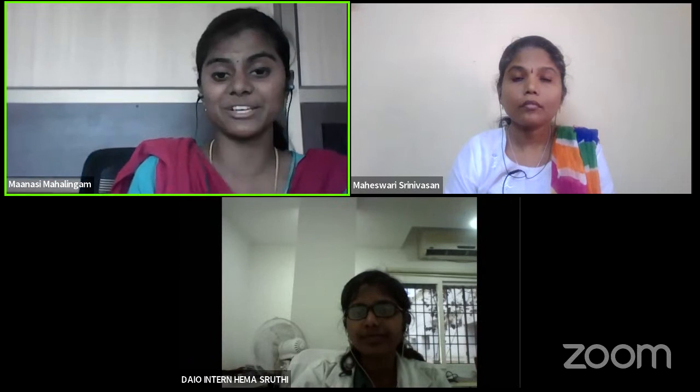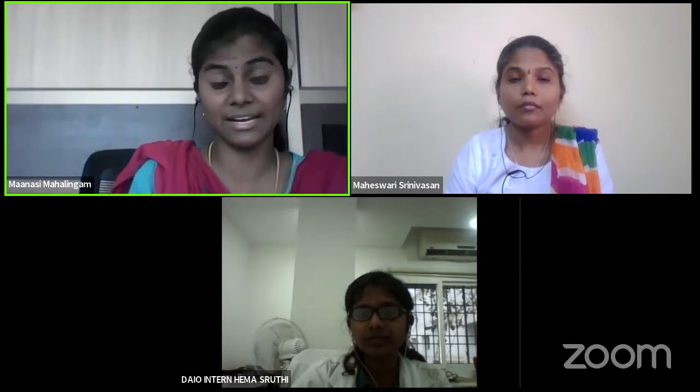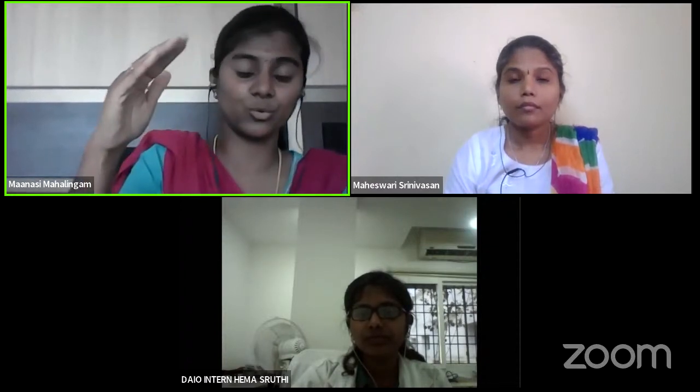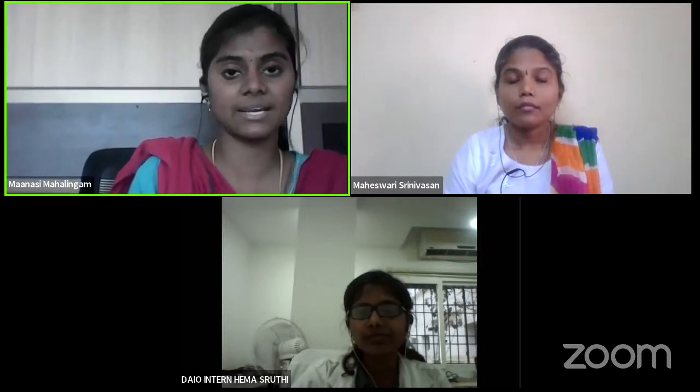And for OCTA, the patient should not even move their eyes or blink in between, even though there are some processes like motion artifacts which can be removed by some software eye tracking system. Not all patients can just stare at the OCT machine for 2 to 3 minutes for the whole OCTA to get completed. For those patients, FFA and ICG can also be done.